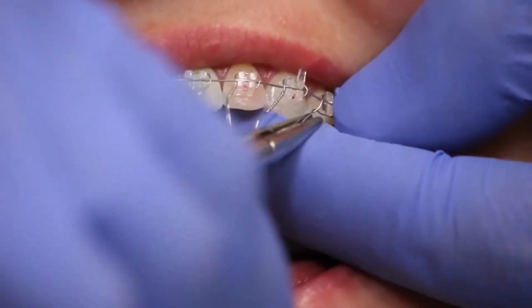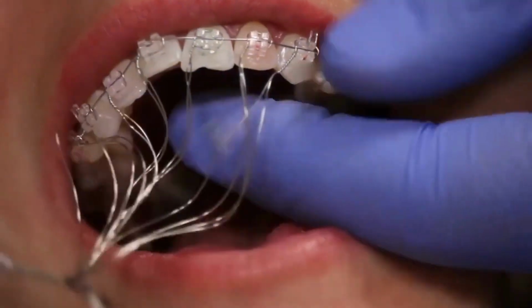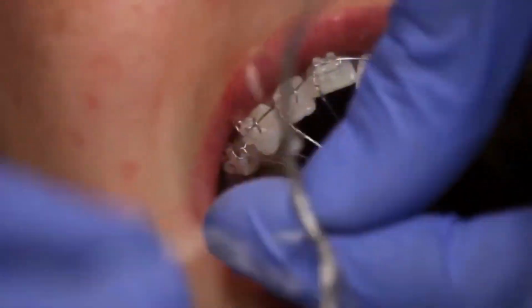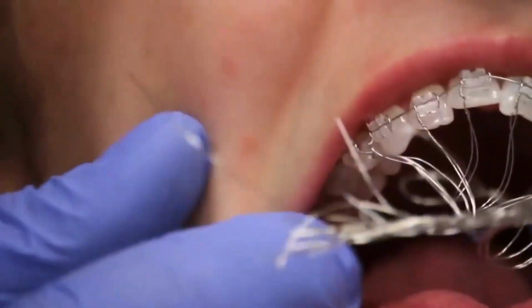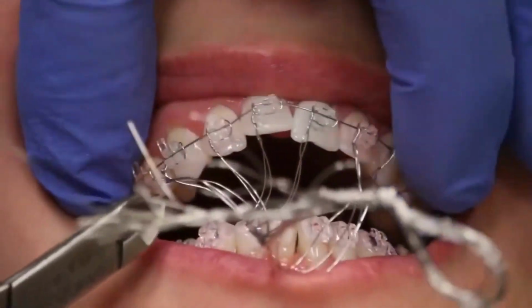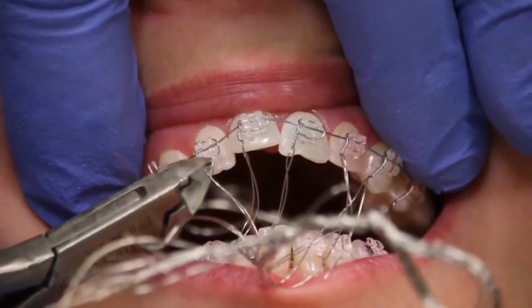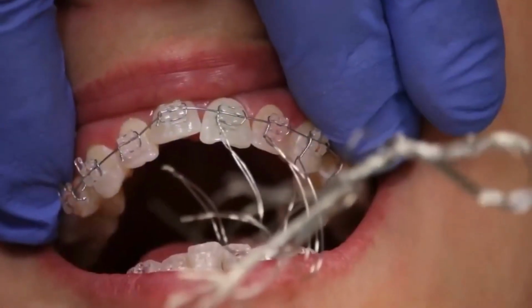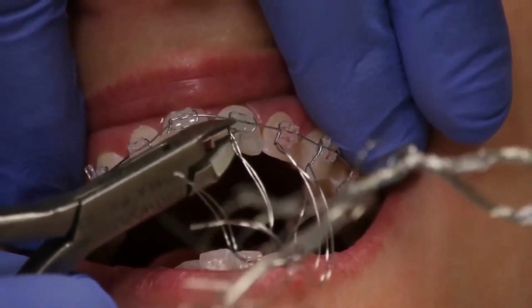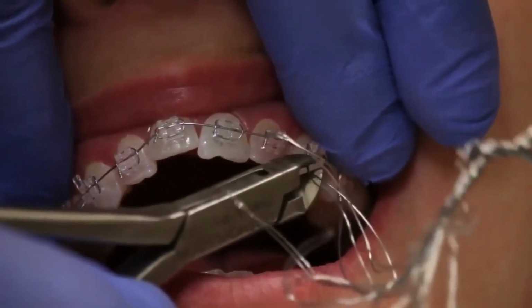There you go. You can see my finger holding the ligature so it doesn't move while I'm grabbing the ligature with my pliers. I put all the ligatures together. As you can see, in this case I made a little knot in here, and now close a tiny bit. Put my fingers in there to protect the patient from being poked with the ligatures, and I cut and push the ligature out of the way. So if you train your assistant to do this, then she can work by herself without having anyone else in your office having to sit on the chair while wires are placed or changed.